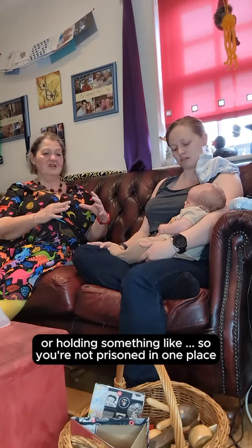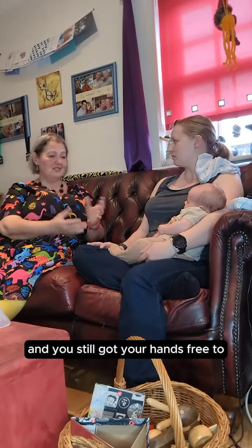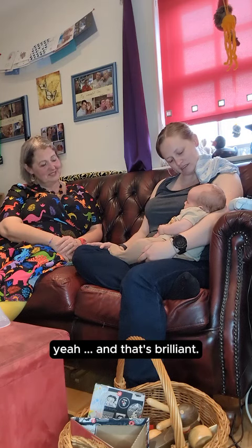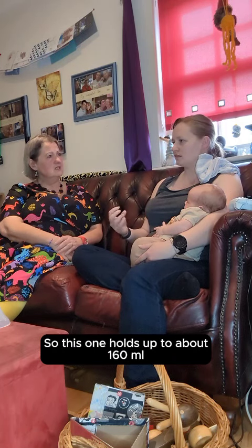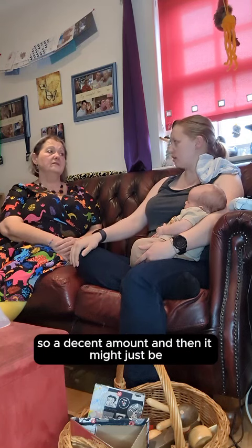So you're not, like, imprisoned in one place while you're doing it, and you've still got your hands free to cuddle the young man, who's happy against the other boob there. That's brilliant, so how much can they hold when you express? This one holds up to about 160ml, so a decent amount.